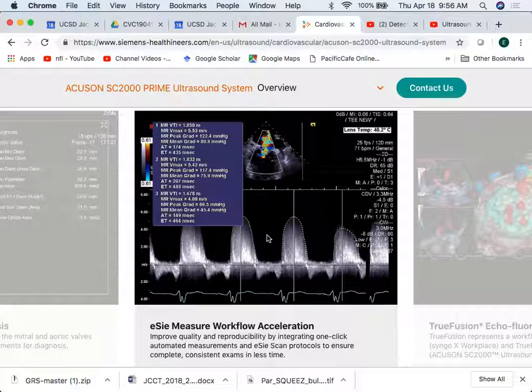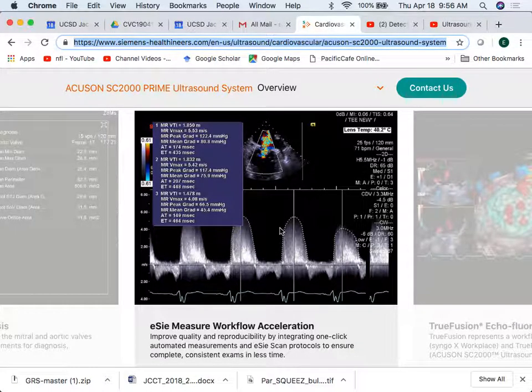And then looking at Doppler, so here, this is the left atrium. Left ventricle would be up here. Our transducer's up here. And we're going to look at velocity across the mitral valve. Okay? And so on this axis, we'll actually plot the maximum velocity measured in this jet right here. Right? And this is time on this axis. Let me turn on the pointer. So this is time on this axis, velocity on this axis.